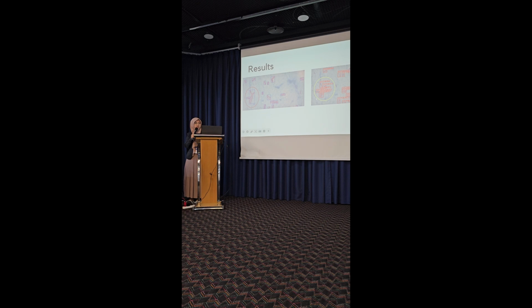So this is the result. On the left, in the red circle, we can see the touching bacilli, where classical image processing just detects 2 bacteria in this image. But on the other hand, on the right image, we can see the yellow circle. YOLO version 5 can give us a better result. We can see that YOLO can detect about 7 or 8 bacteria in this image.